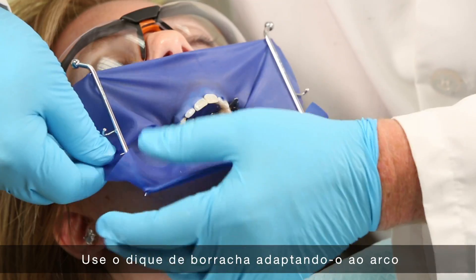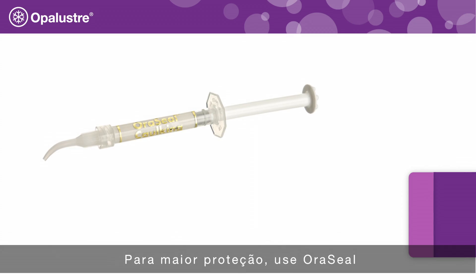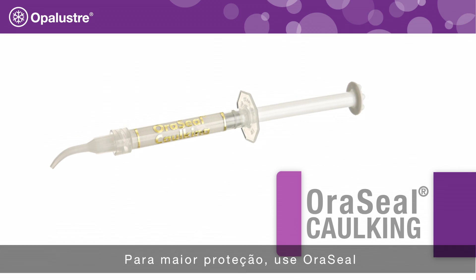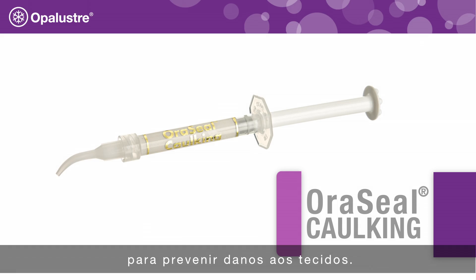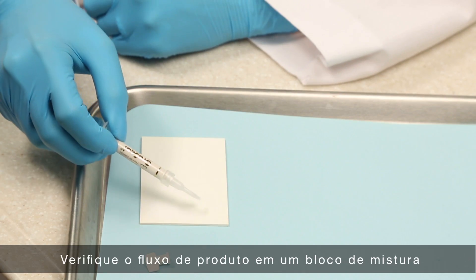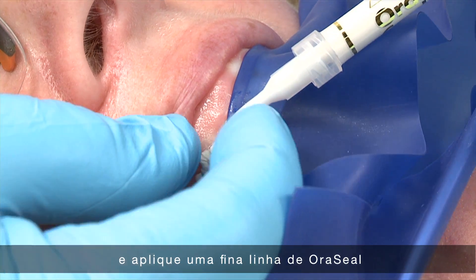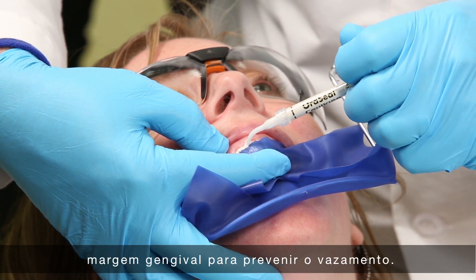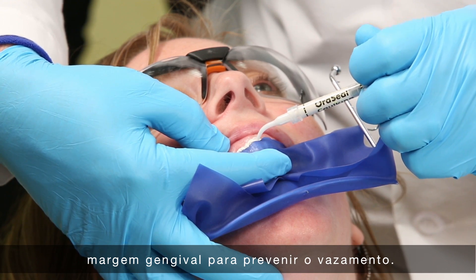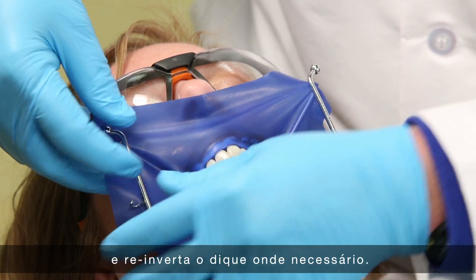Apply the rubber dam attaching to the frame and inverting the dam at the gingival border. For additional protection, use OraSeal caulking to prevent tissue damage. Simply peel back the rubber dam to expose the tissue, then express a thin ribbon of OraSeal caulking beneath the rubber dam along the gingival margin to prevent leakage. Reattach the rubber dam to the frame and re-invert the rubber dam where needed.